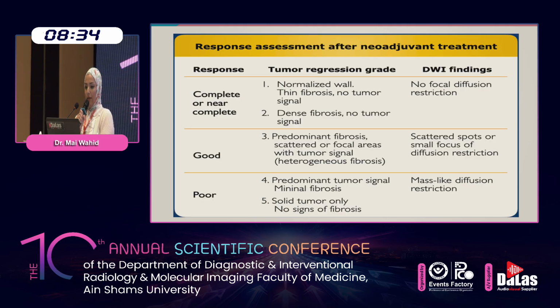So here we can see the response assessment after neoadjuvant treatment, either complete or near complete, good or poor response, based on the diffusion findings. So it's a very important sequence.